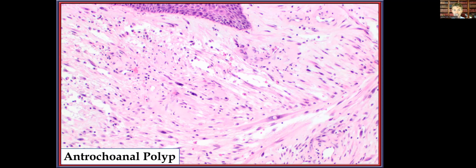But when you look at the spindle cells, they can be quite remarkably atypical, as you will notice with this one here showing an intranuclear cytoplasmic inclusion. And these, of course, will be desmin reactive, but will not be reactive with nuclear beta-catenin nor with a nuclear androgen receptor.